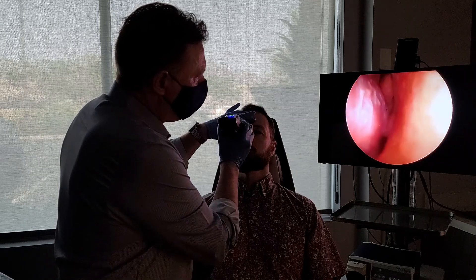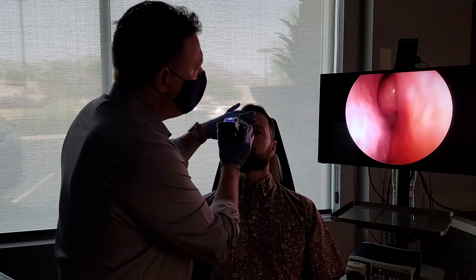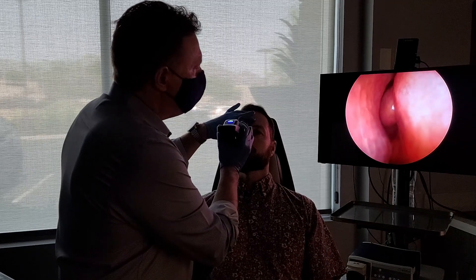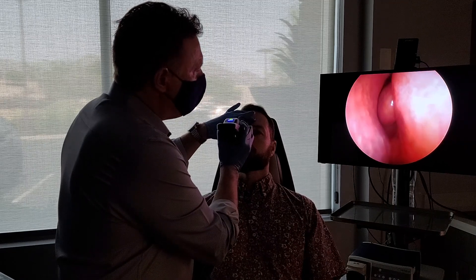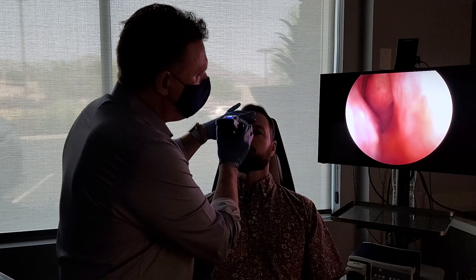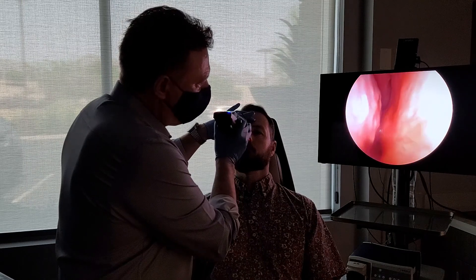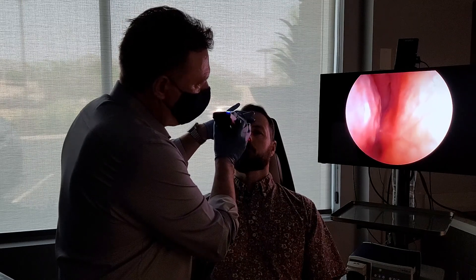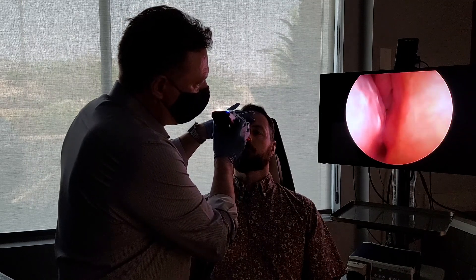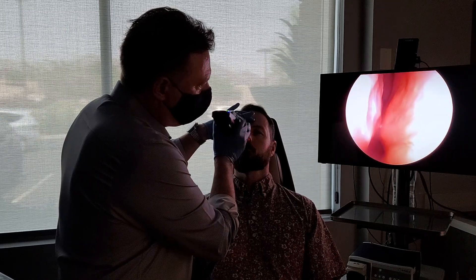The inferior turbinate is right behind, and the middle turbinate is up above. If we go back a little bit farther and look inferiorly, we can see that Kevin also has a septal spur that is touching the inferior turbinate on that side. That's right in front of us.